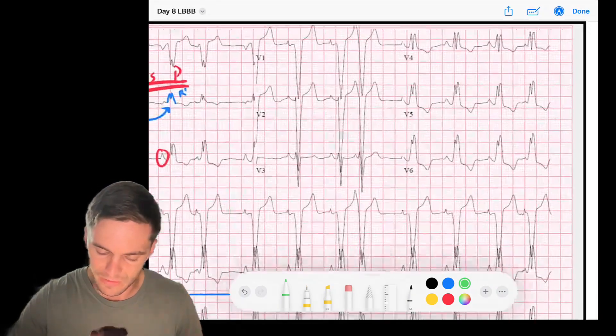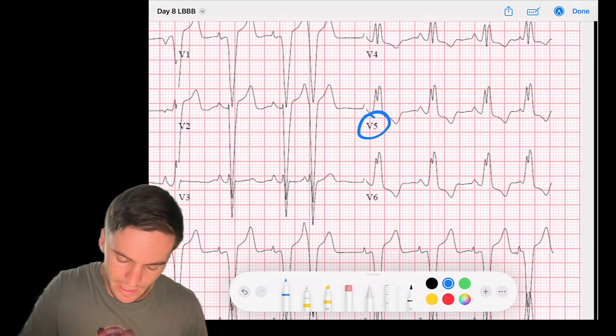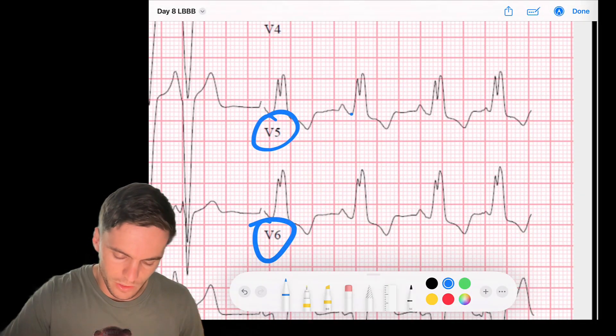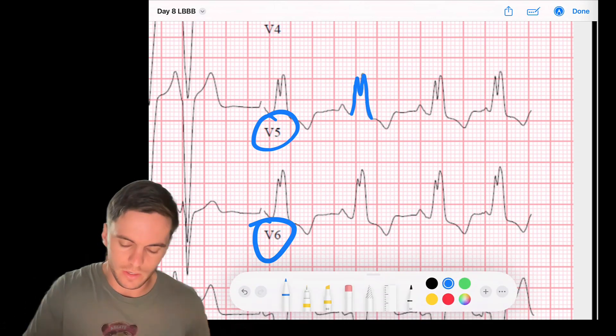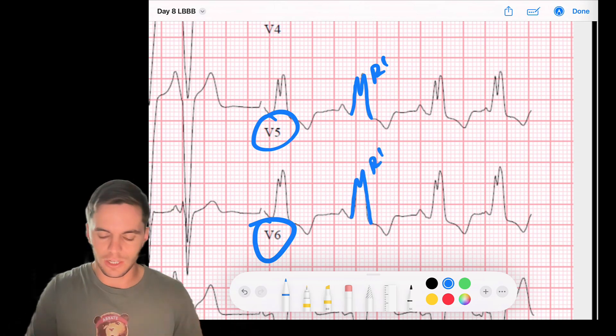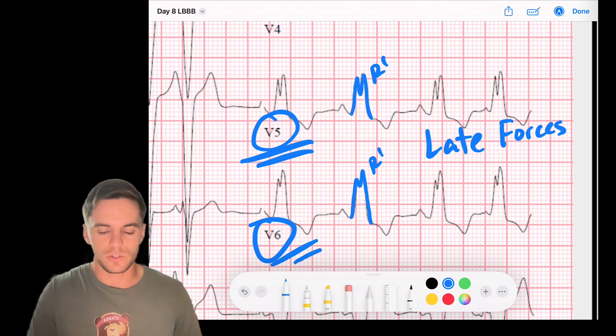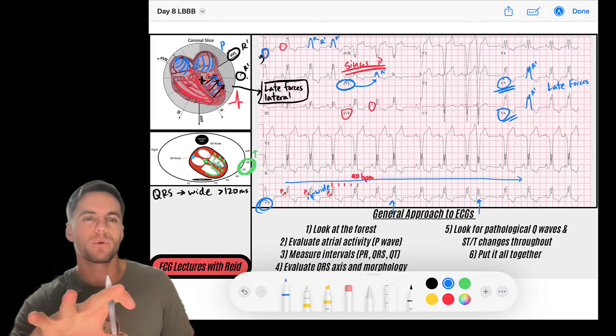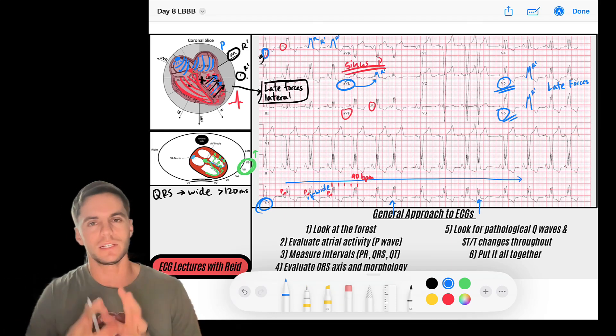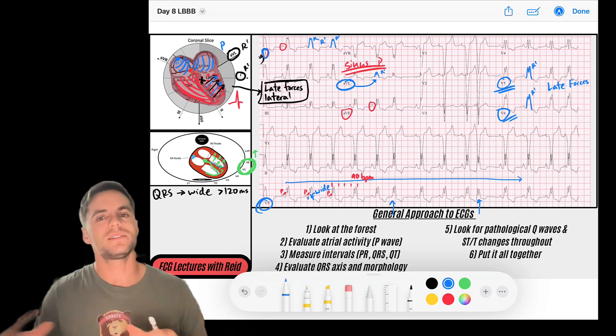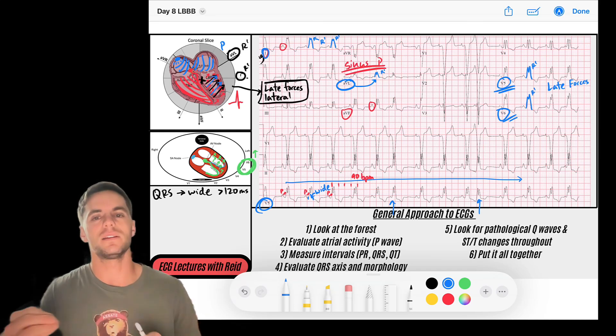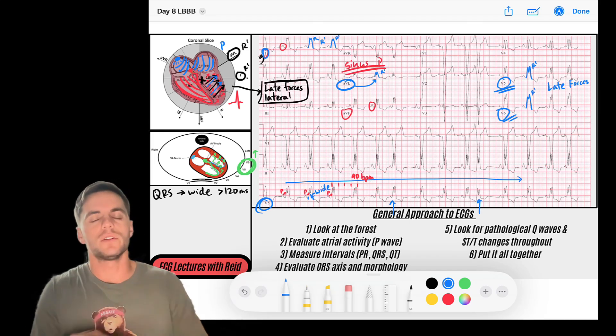And if I look at V5 and V6, sometimes you can see that here. Notice we have our nice upstroke. We should expect for it to come down, but then we have another later R prime, just like that in V6. Oh, there's the later one, that R prime. That tells me that there are late forces heading towards V5 and V6. So I'm starting to think, why would there be delayed forces towards the left side of the heart? It could be because the left bundle is blocked. And so rapid signal is not getting to the left ventricle. It's actually going to be delayed signal causing QRS widening, and there's R prime forces.